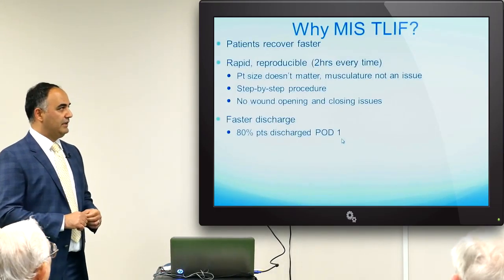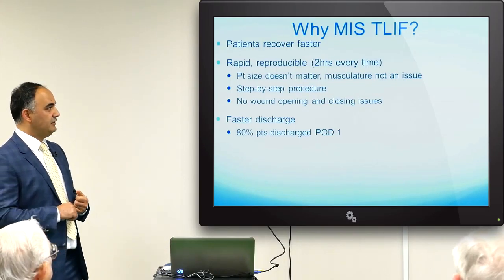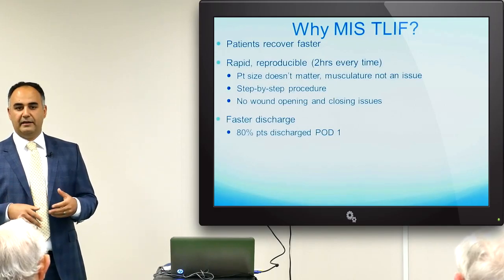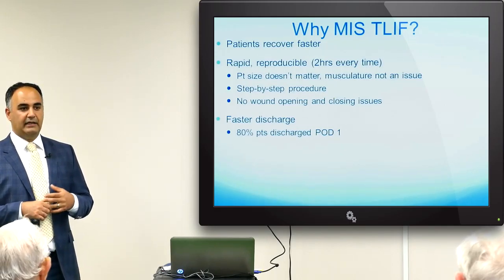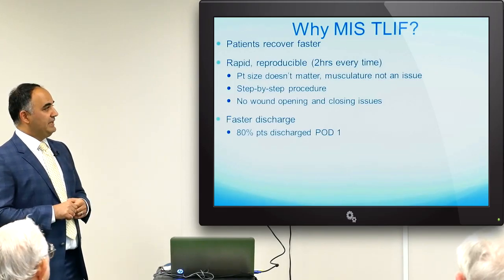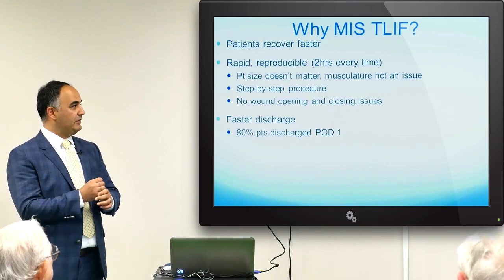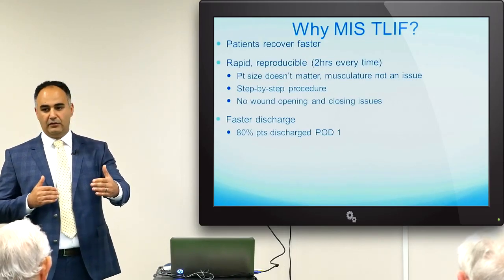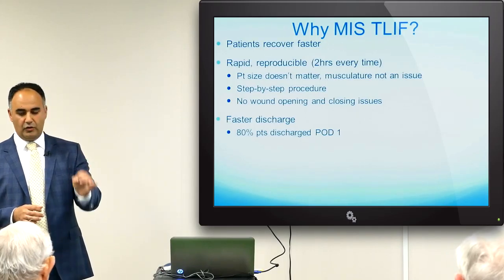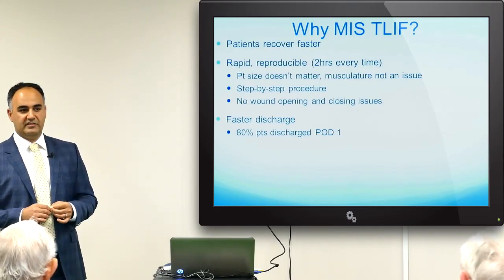So why do I like that particular fusion surgery? Again, patients recover faster. It's pretty reproducible. So for me, it's about 2 or 3 hours every time. It helps me plan my day, and also I know what's coming next. The patient size doesn't often matter because we're working through those tubes. Typically, when you have a larger patient, you have to make a larger incision in order to move everything out of the way. But with these tubes, it's always going to be that same 22-millimeter tube, 26-millimeter tube going down. So the size doesn't matter.